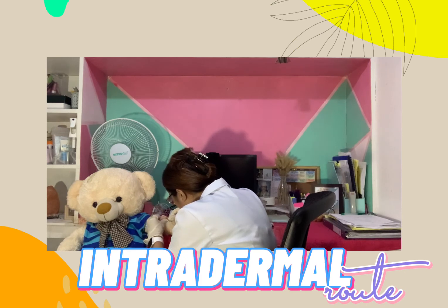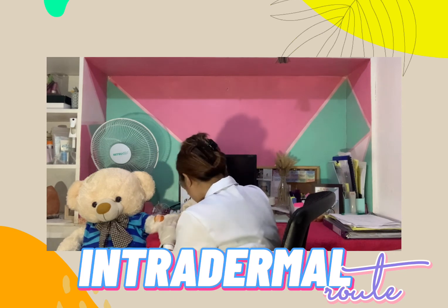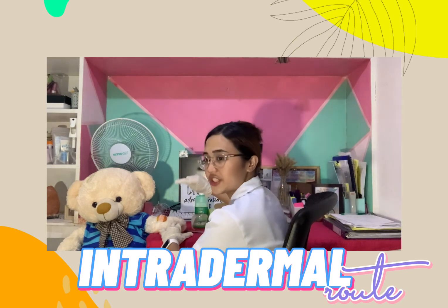the patient, and then we need to steady our syringe and needle, and then we will now administer the medication. We will need to form a bleb or wheal, and then when the wheal is already formed, we will remove the syringe at the same angle that we inserted it. We will discard it, and then we will not massage the area.